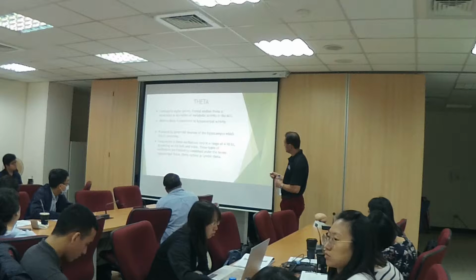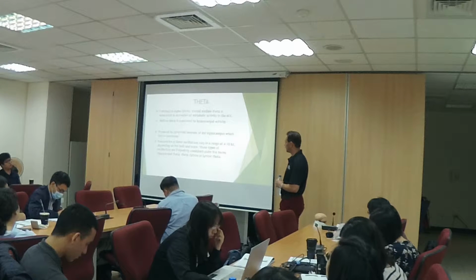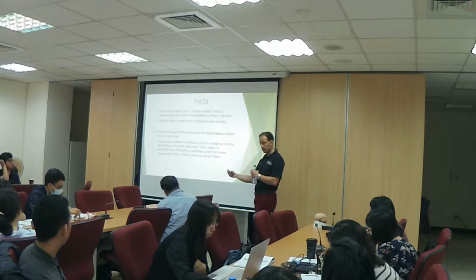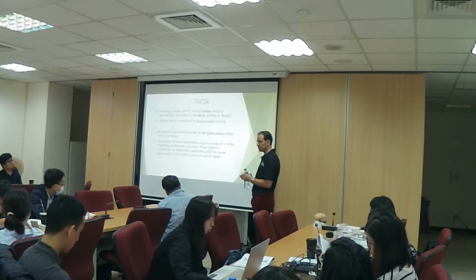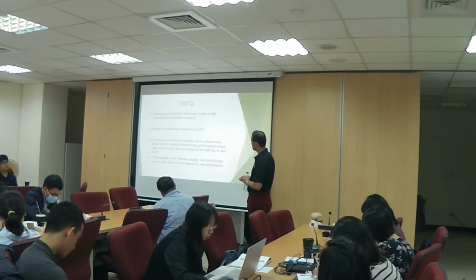The midline that we see is activity from the hippocampus by those pyramidal neurons. And they can change between 4 and 10 hertz. So even though the traditional conventional range is 4 to 8, in the EEG you will see sometimes 10 hertz, alpha type alpha. Okay? And we'll see what that looks like.